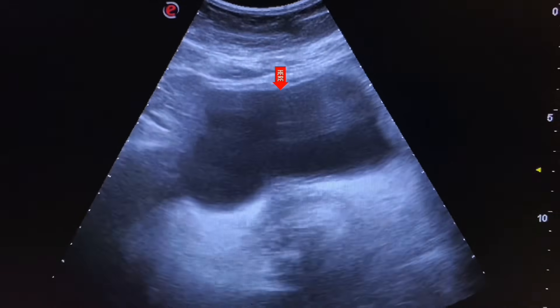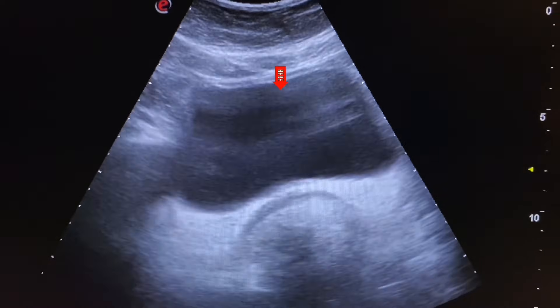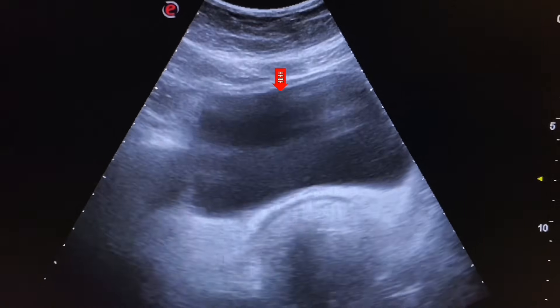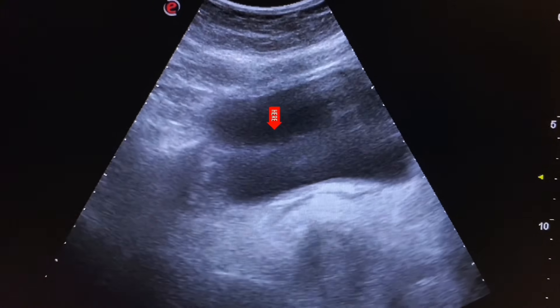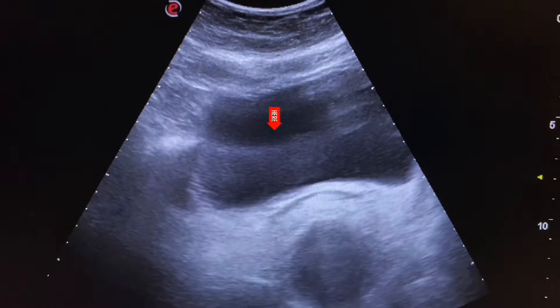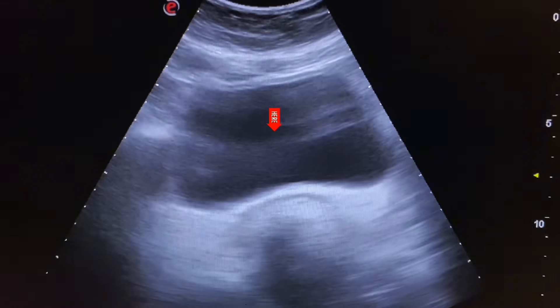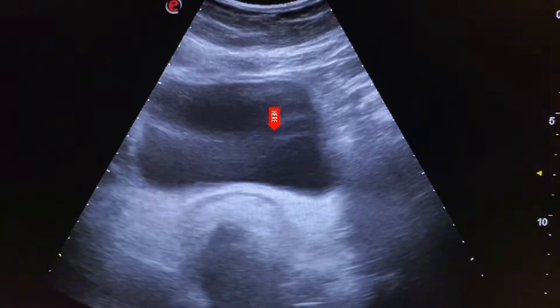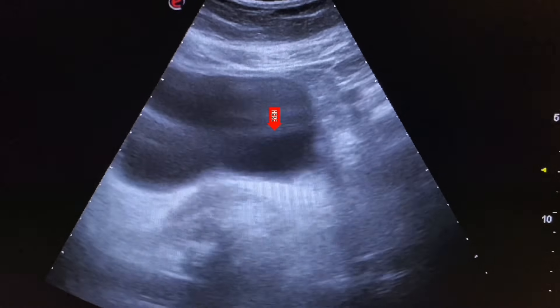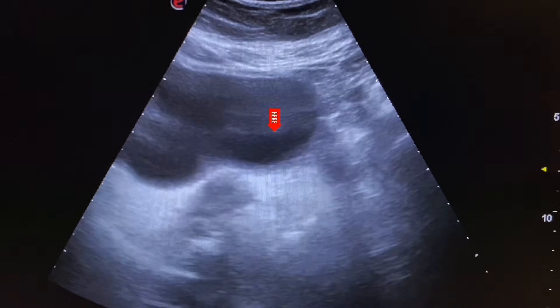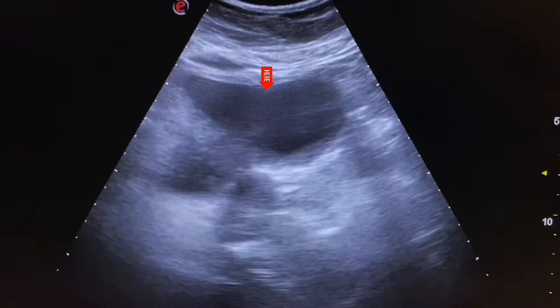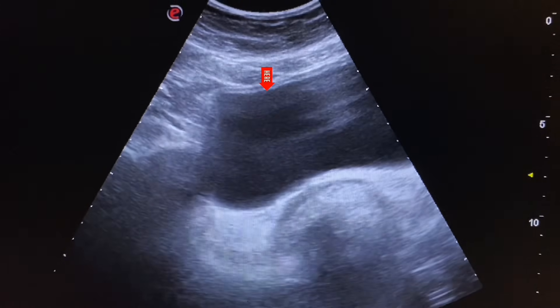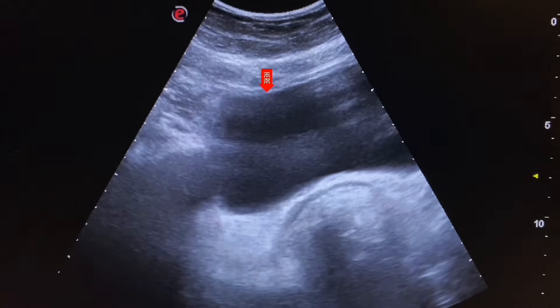Now we scan the pelvis. This is the urinary bladder. These are reverberation artifacts, which occur when ultrasound waves bounce back and forth between two reflective surfaces and appear as parallel lines in the ultrasound image.